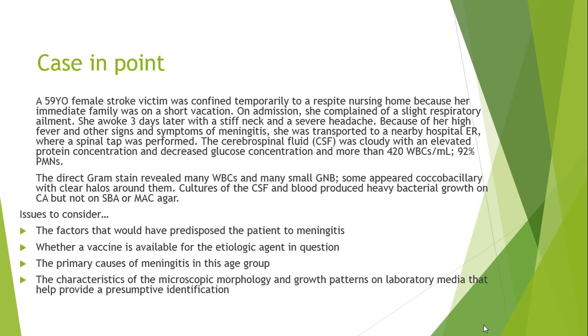So that puts it in this category, a gram-negative bacilli that's fastidious. Okay? So if it's not growing on McConkey, it belongs in this group. Everything else should grow on McConkey.